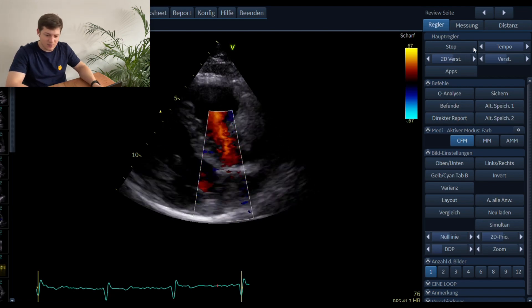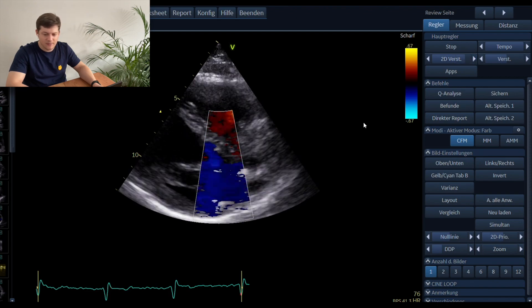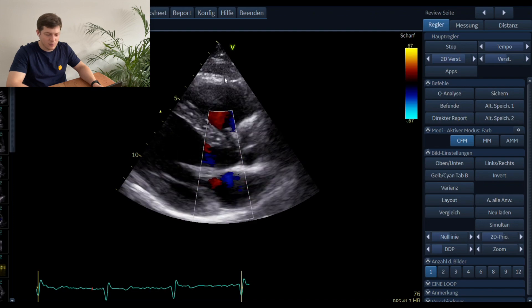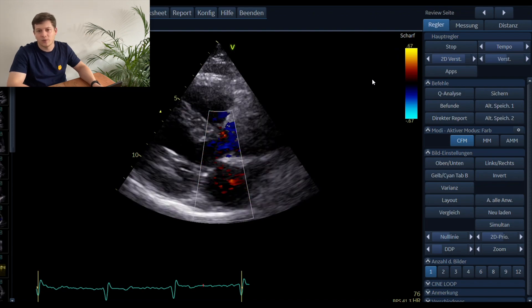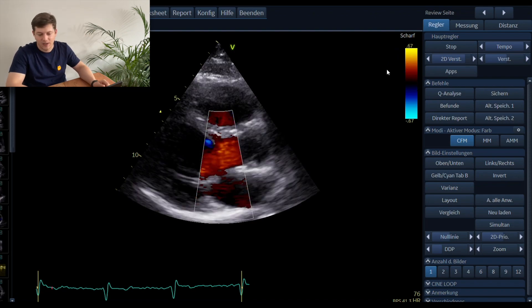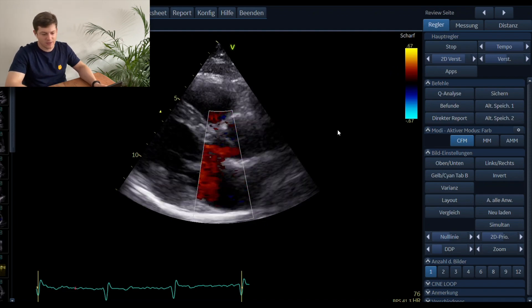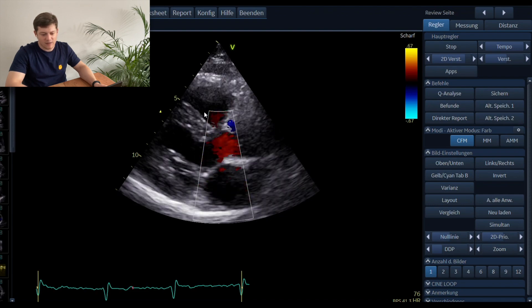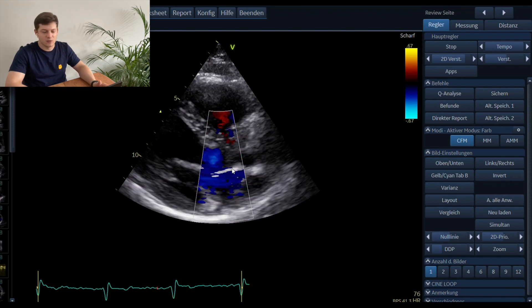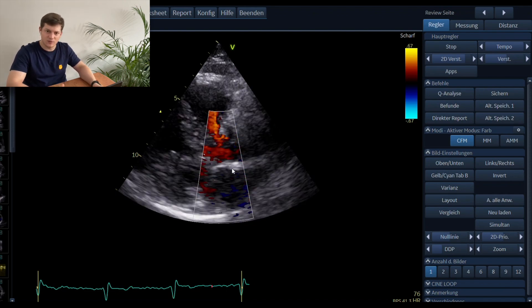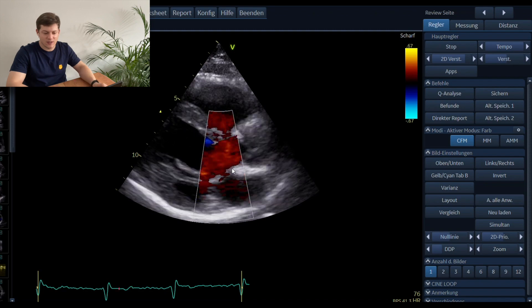For color Doppler we use a little bit more gain so we can see the heart more accurately. We place the color Doppler box over here — always take a look at the PRF, which is normally around 0.60 or 0.70 meters per second. It is mostly red towards the transducer and blue away from the transducer. In this case I placed the color Doppler box over both valves.